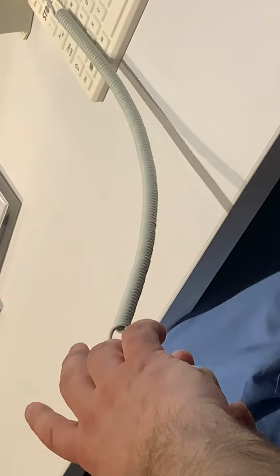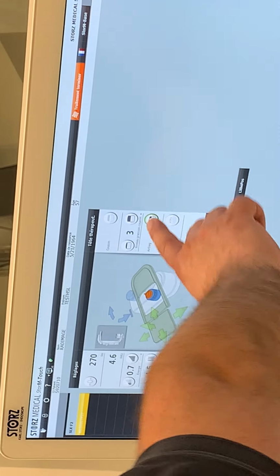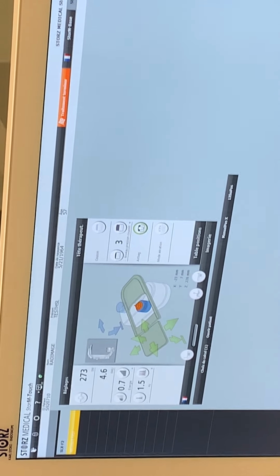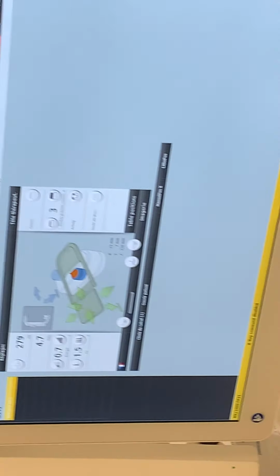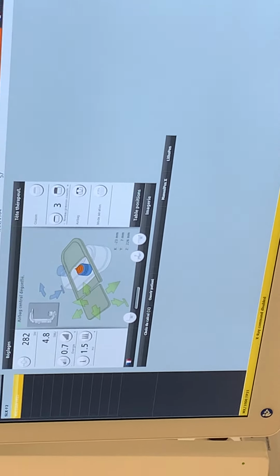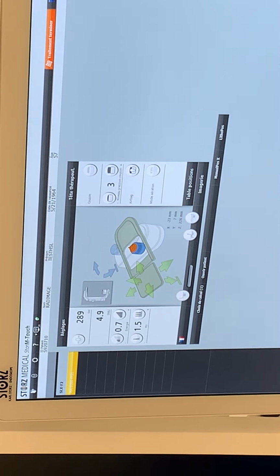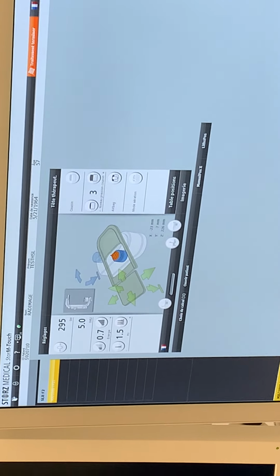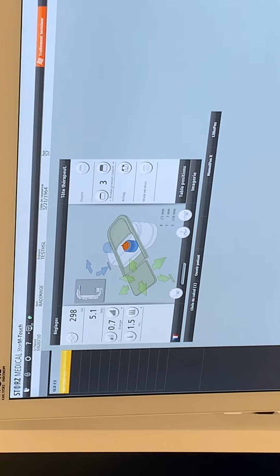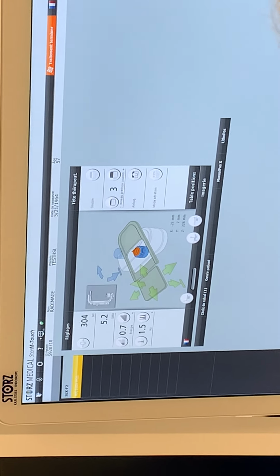Then you will release the black magic button. You will see everything is grayed out again. And the airbag needs about 8 seconds before it deflates automatically. Please never forget the black magic button because of the airbag. If you forget the airbag, you will get a bad image quality, higher dose to the patient, and a higher kV. Without it, you have a very bad image quality.